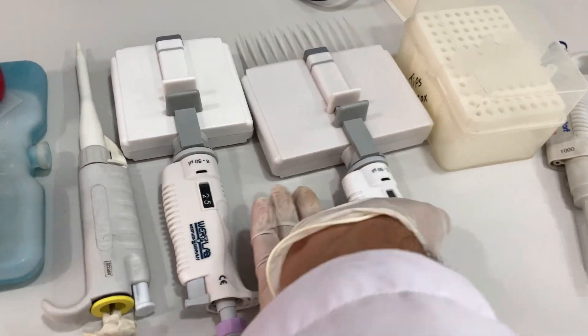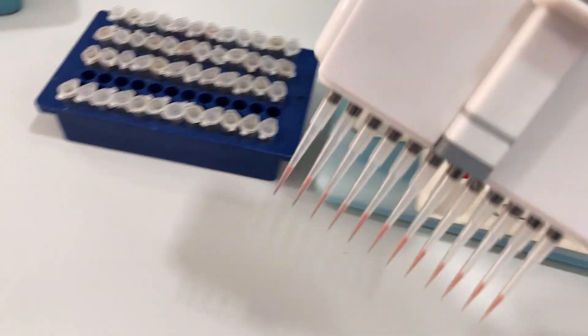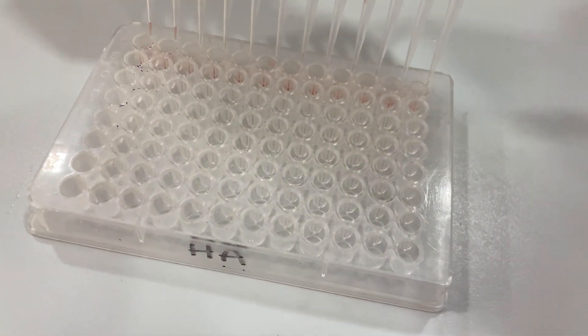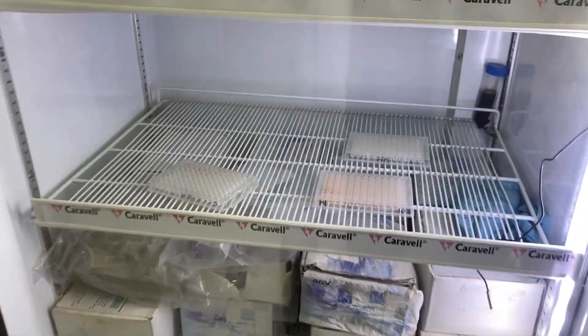The next step we are going to perform is to add 25 µl of 1% washed RBC in all wells. Now incubate it in the fridge for 30 minutes, and after that you can see the results.